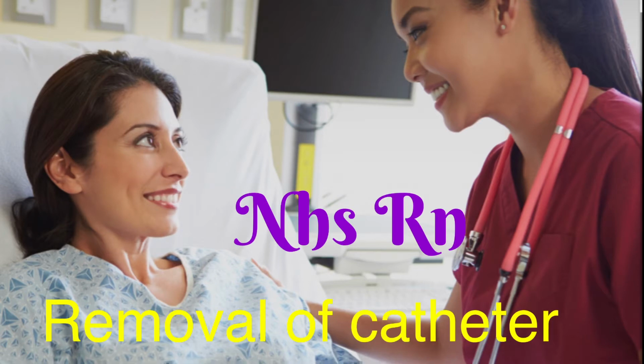Then you need to explain to the patient very well, so that you and your patient understand what is going to happen, the patient is a bit more comfortable and you can do the procedure very easily. So you can say to the patient that removal of the catheter shouldn't hurt, although you may feel slight pulling, or you may feel some urinary retention, or some little discomfort when I take your catheter out or when you pass urine.